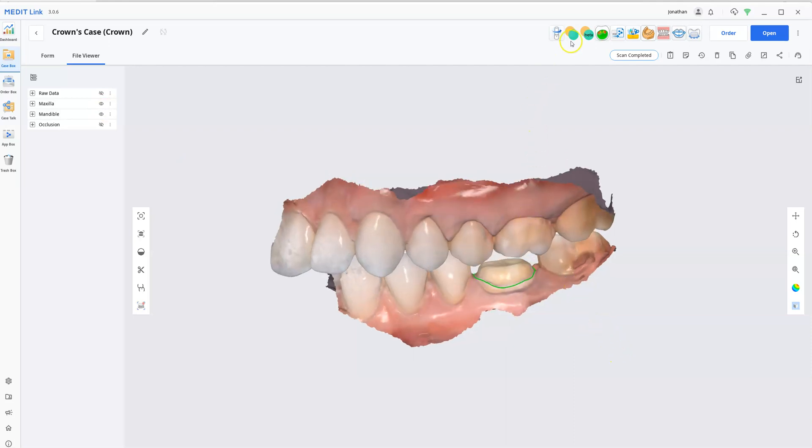Because we have the app, the Clinics app, built into MeditLink, all you have to do is come up here to the top and click Clinics CAD and it will automatically launch the Clinics web browser.